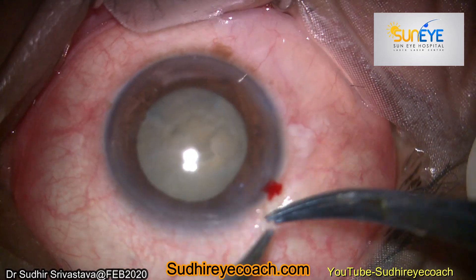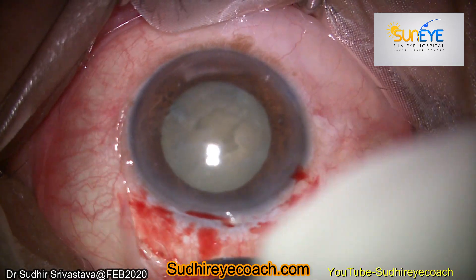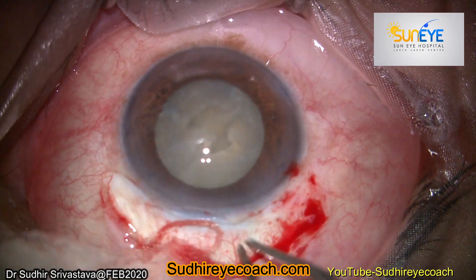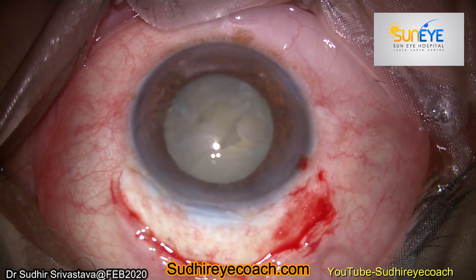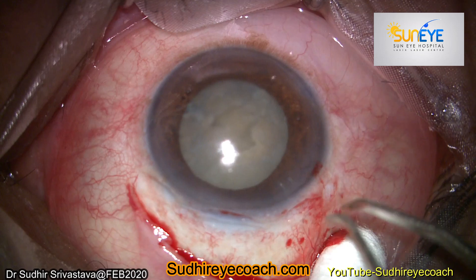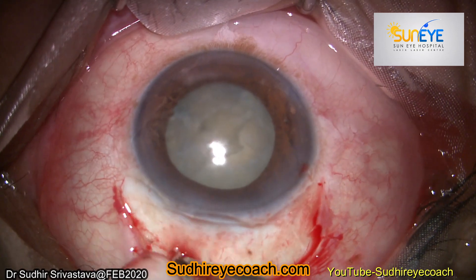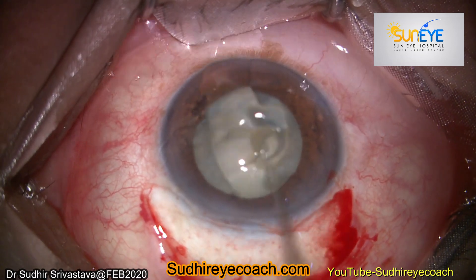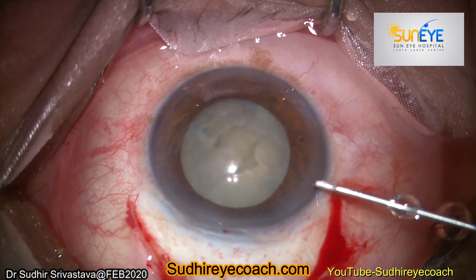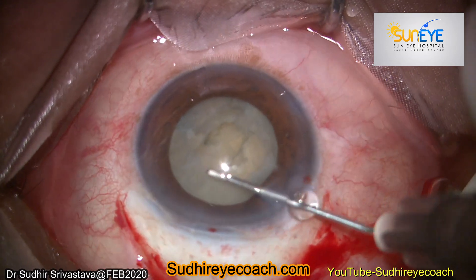With time we develop sensors to recognize complications quite early. I always say that every surgery is a different surgery — because we have chosen such a profession, we have to train our mind to face surgical complications. With experience, we develop our skills in such a way that we start recognizing complications quite early. Several thoughts came to my mind: I can use an endocapsular ring, and I can also use a capsular hook to stabilize the bag.